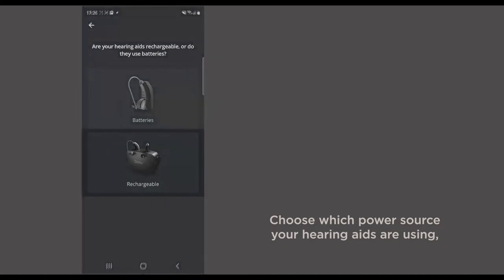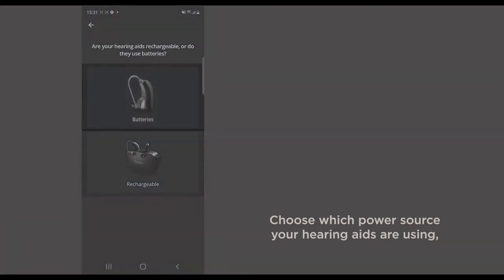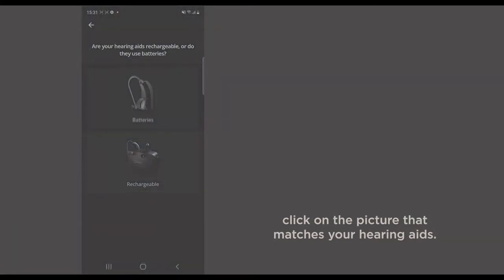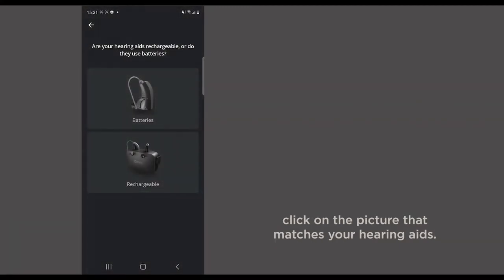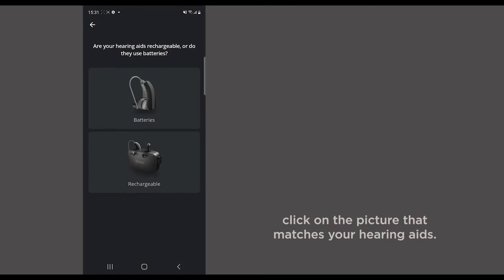Choose which power source your hearing aids are using. Click on the picture that matches your hearing aids.